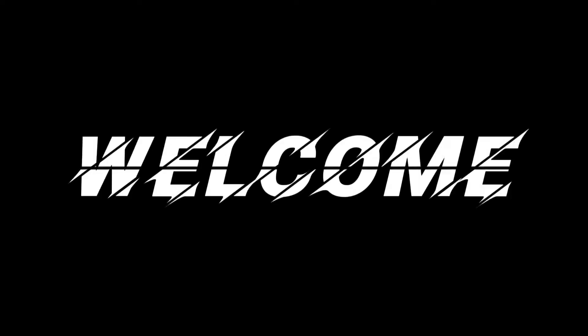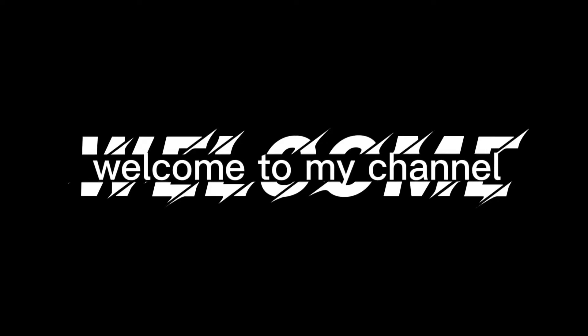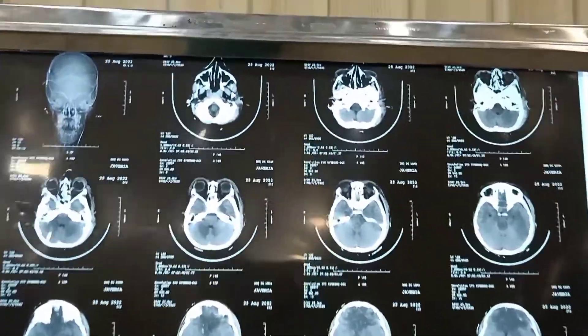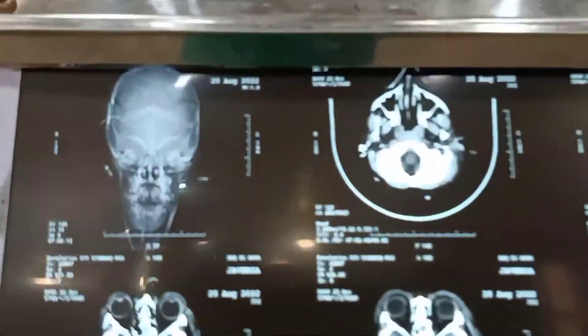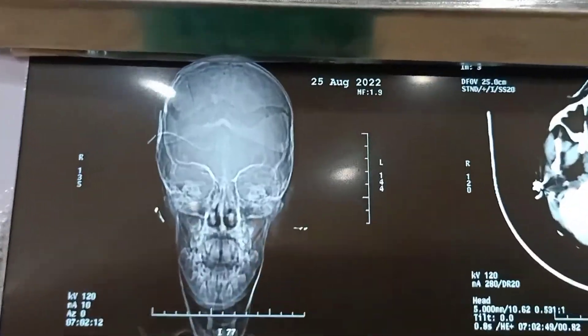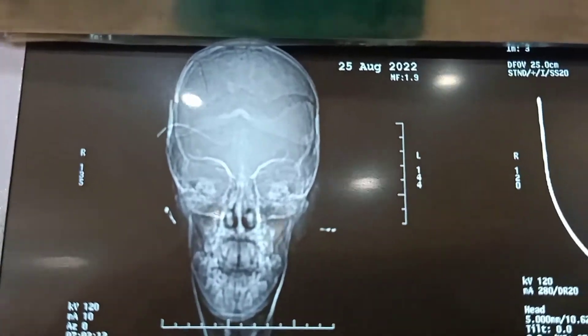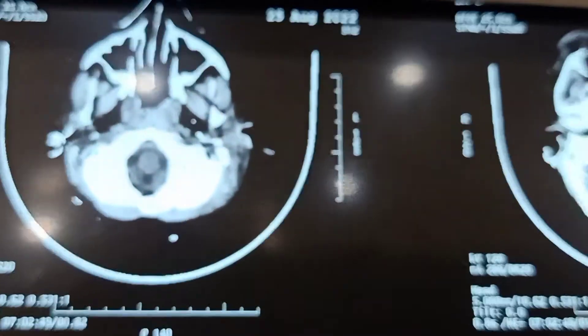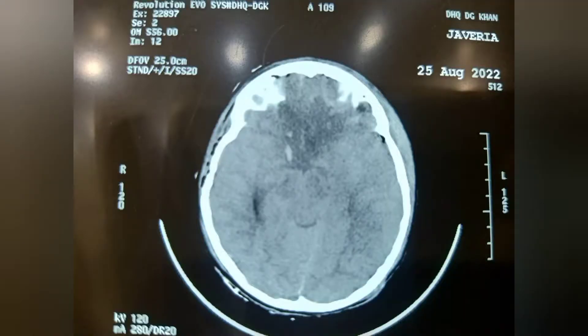Dr. Ehmer, kindly tell us more about radiological investigations. Basically, this is the CT scan brain, axial view. It's an amazing CT scan, especially for medical graduates, because it covers a lot of information.